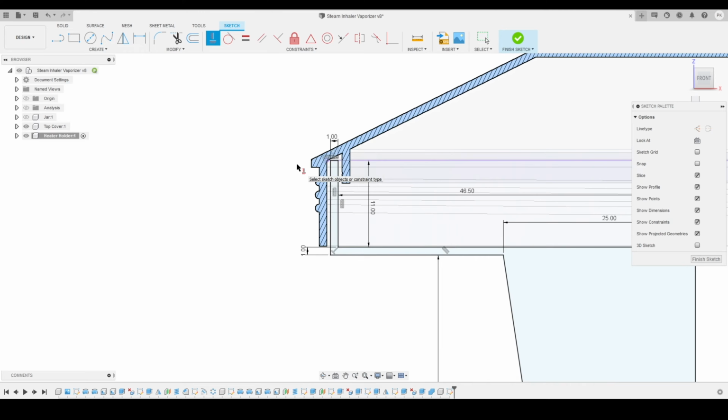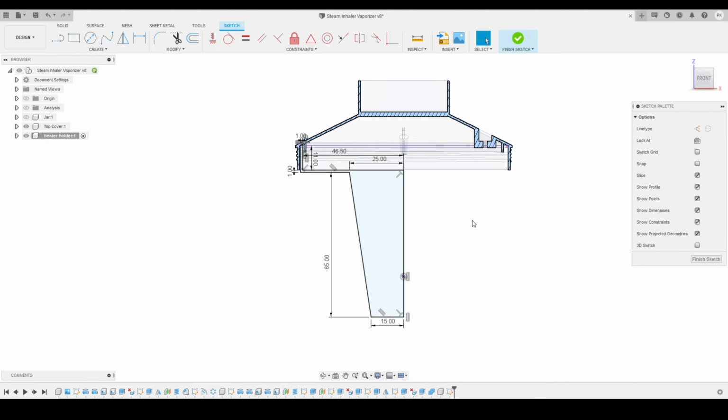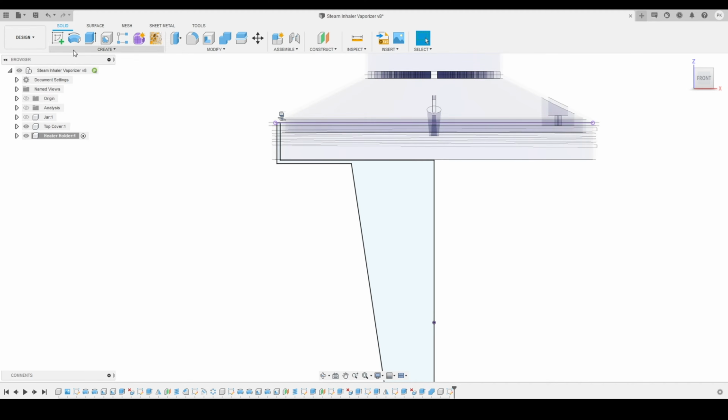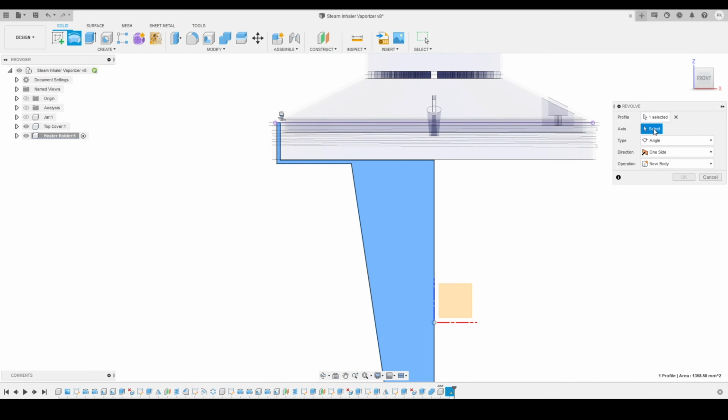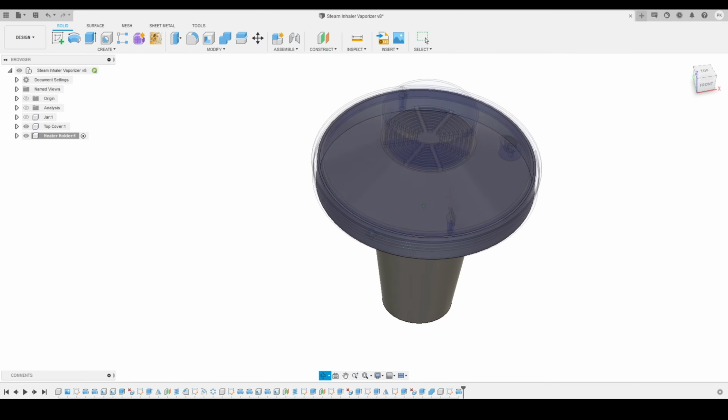So here you can see we had just finished the sketching, and I will click on the finish sketch to accept my sketch, and I had used few of the projected sketch from the top cover. So now I had activated the revolve tool. I had selected the profile and pressed OK. So this is the revolve shape I am getting.